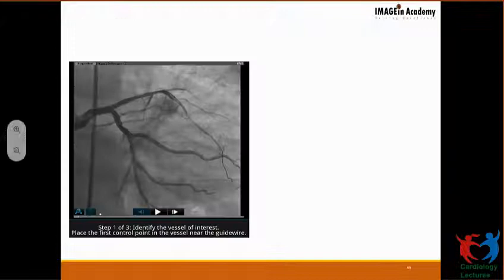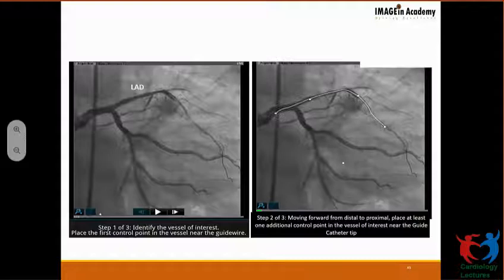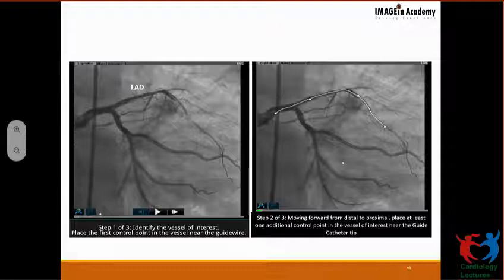Once you've acquired the angiogram, this is what we've done for the LAD, then you have to mark it, moving from the distal to the proximal end. And once you've marked it and you are reasonably sure, and you come to the end of the catheter tip, you press the button and you confirm it.